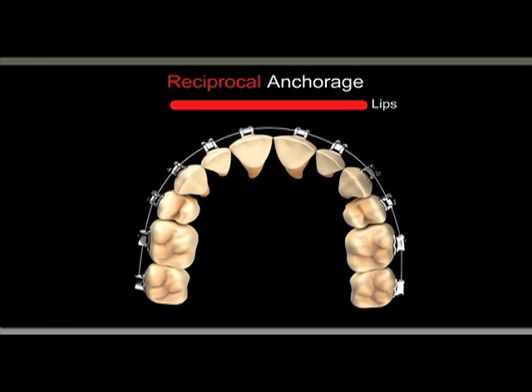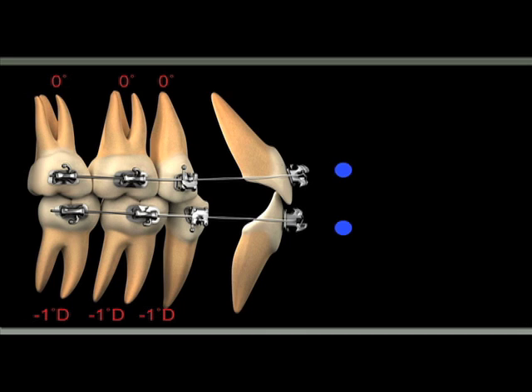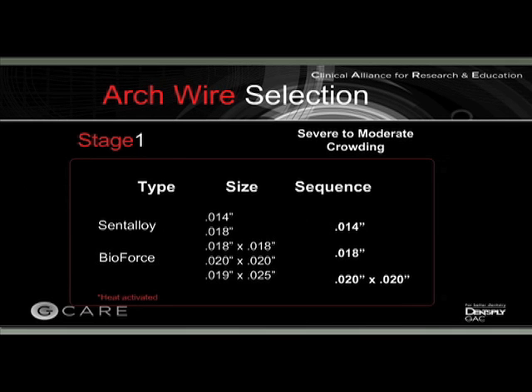This is something we see specifically in self-ligation, when we allow the wires to move freely on the tubes and on the brackets. Also, when you combine that with the uprighting of the molars, as you can see here, we start with round arch wires that don't have any torque effect on the incisors or on any tooth. However, they can tip and rotate the teeth without any problem. So if you start leveling and aligning, the molars and premolars also rotate back and upright, and many times they move the incisors back and upright them too, specifically in extraction cases.